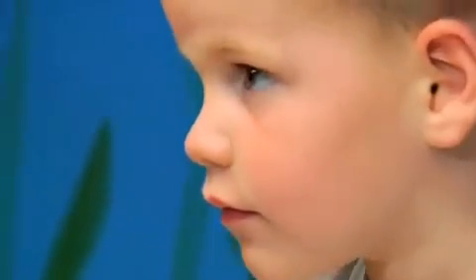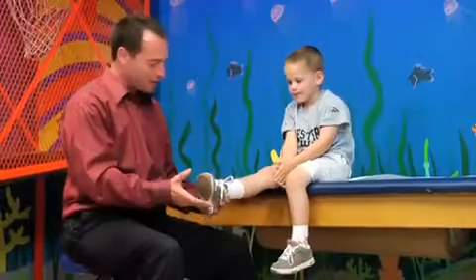With that, Kyle's SureSteps are all fit, his shoes fit well, and he's all set and ready to go.